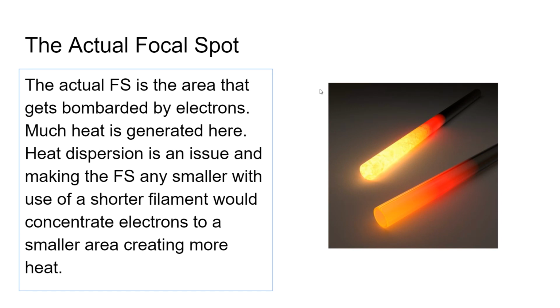So this is the part that is actually having a physical interaction with electrons. Okay, actual focal spot. And we know that's the source of most of the heat in the tube, is those interactions. That's the reason why we spin the thing really fast. That's the reason why we play with the diameter of the anode, too. Sometimes it's a bigger or a smaller frisbee, so to speak.